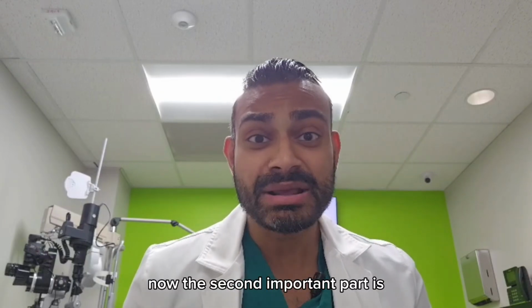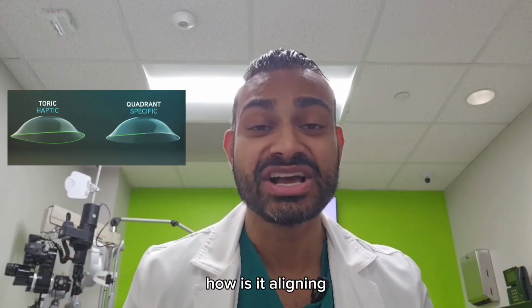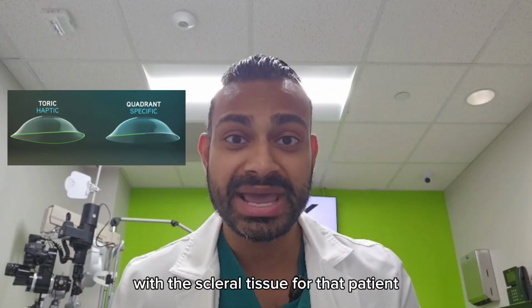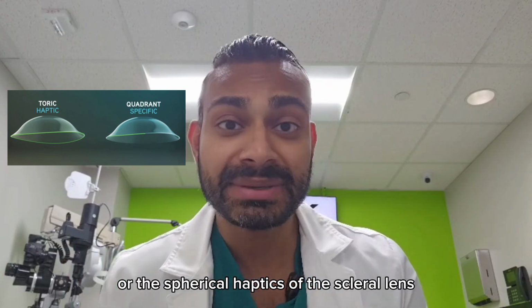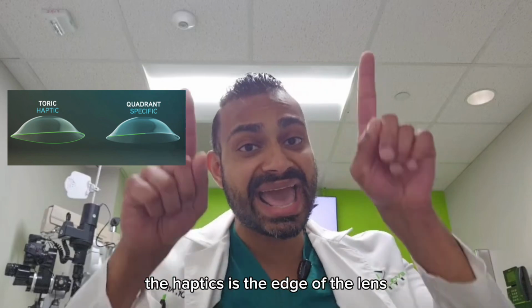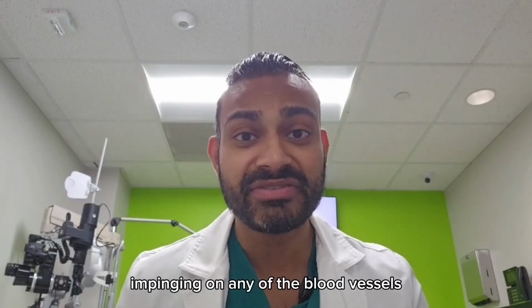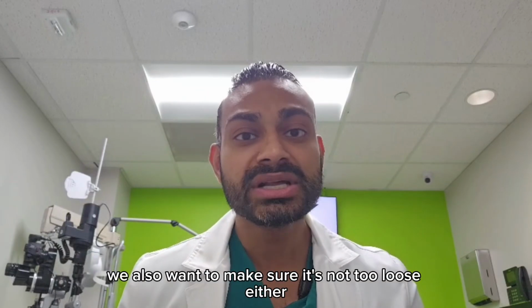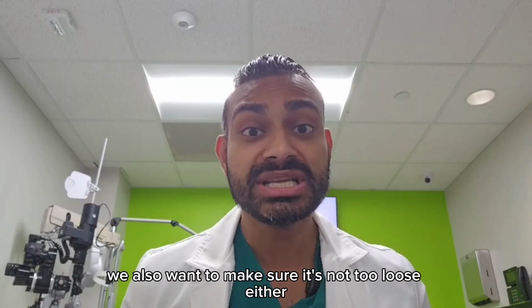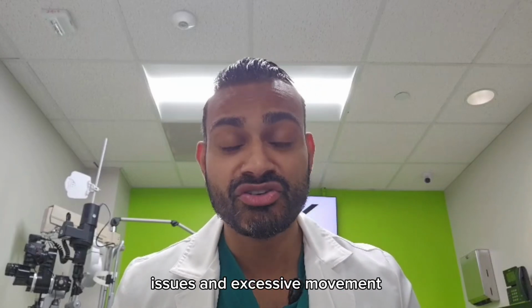Now, the second important part is the actual fit of the scleral lens. How is it aligning with the scleral tissue for that patient? So we're looking at what's called the toric haptics or the spherical haptics of the scleral lens. The haptics is the edge of the lens. We want to make sure it's not impinging on any of the blood vessels. It's not causing any blanching of any of the blood vessels where it's too tight. We also want to make sure it's not too loose either. That can cause lens awareness, can cause discomfort issues and excessive movement.